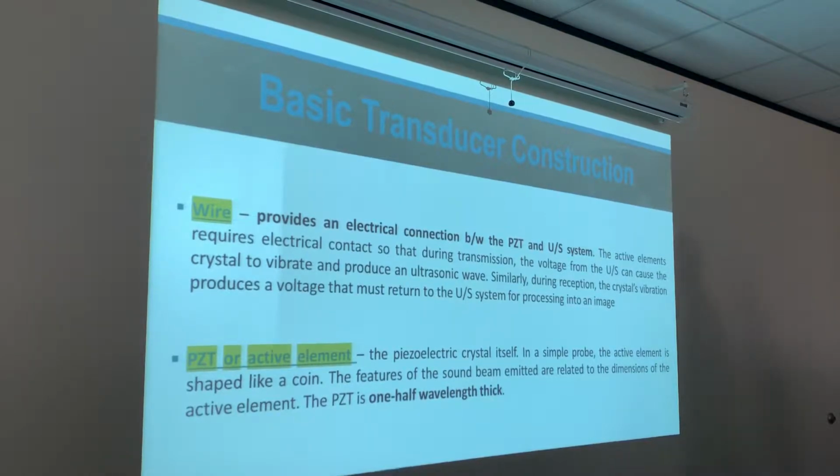Okay. So the PZT or active element, remember, these are just quick little summaries right here, guys. We're going to delve deep into the PZT, the matching layer, and the damping layer. Okay. So the PZT, also known as the active element, also known as the ceramic, or crystal. Okay. The PZT, we need that. We can't have ultrasound without it, right?